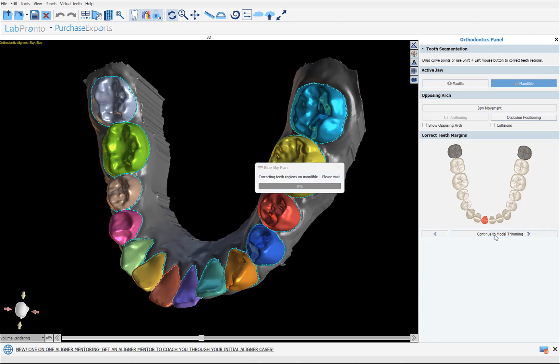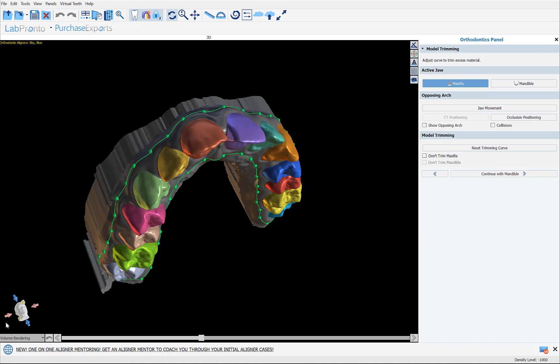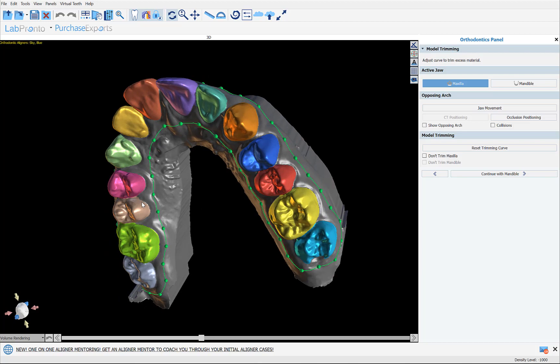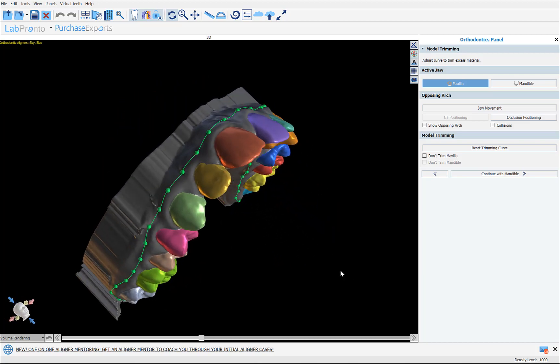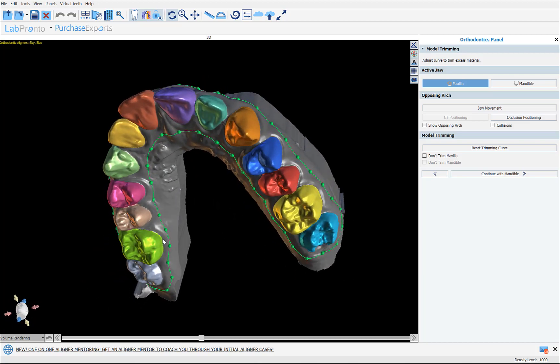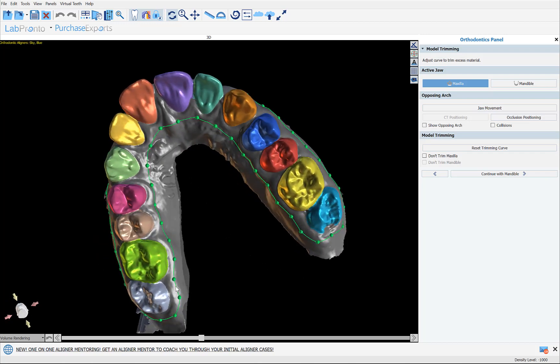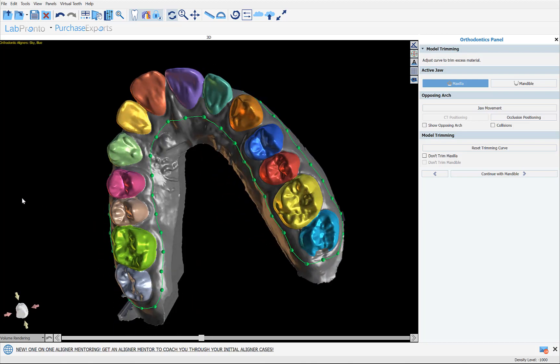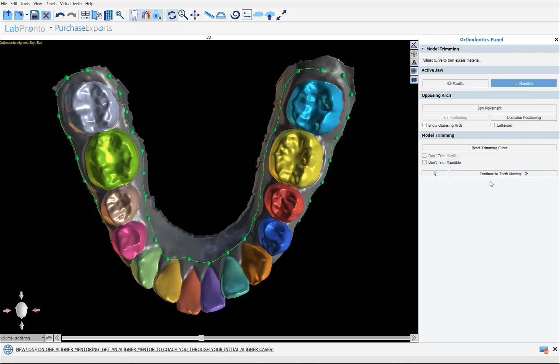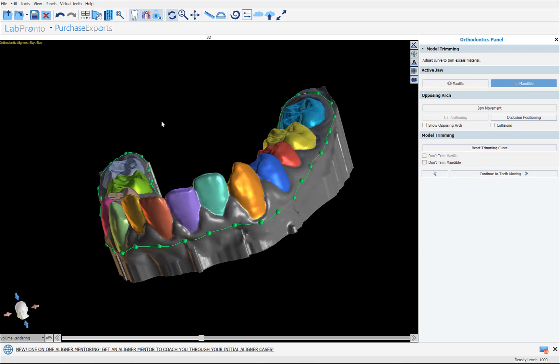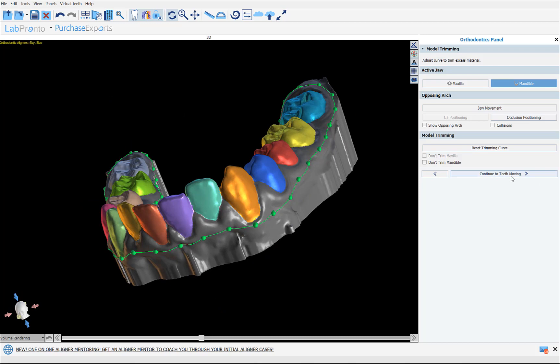I'm going to click Continue to Model Trimming, and the software has automatically drawn a trim curve, meaning that anything outside the trim curve will automatically be removed and cleaned up. If you want to fine-tune the trim curve, simply grab and drag any of the nodes. I'm going to click Continue with Mandible — once again we can review the trim curve — and then click Continue to Teeth Moving.